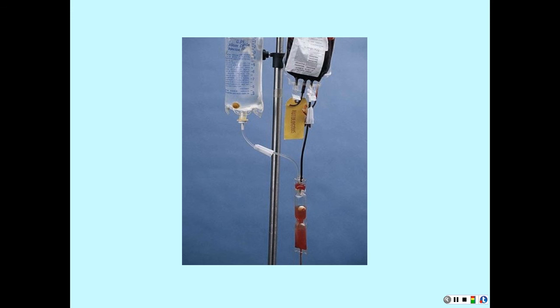They mix right here, but it's just saline. That's all you can hang with blood, is saline. And you're not going to take this tubing and piggyback it into D5W.